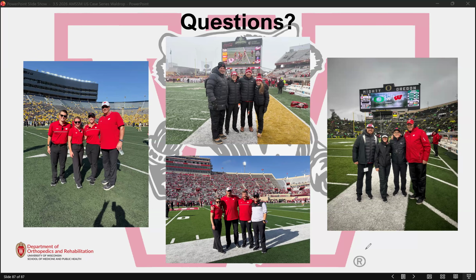And then we're really big on compression and immobilization following any of these aspiration procedures, and in particular around the knee. So this is one of the few circumstances where I actually will put someone in a knee immobilizer. The reason is we want those tissue planes to scar together. We don't want them to slide relative to one another. So I think immobilization and a lot of compression after these is really important.